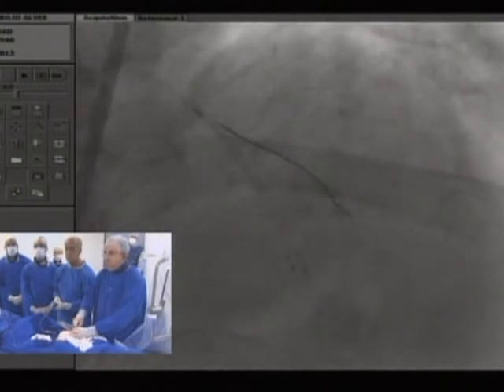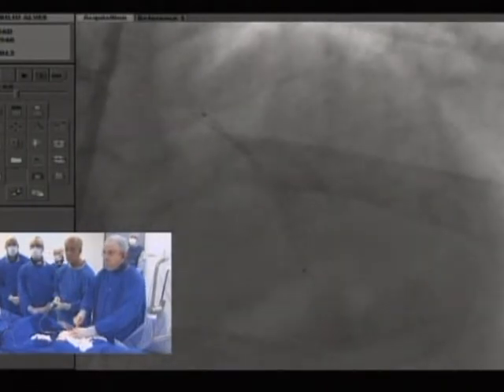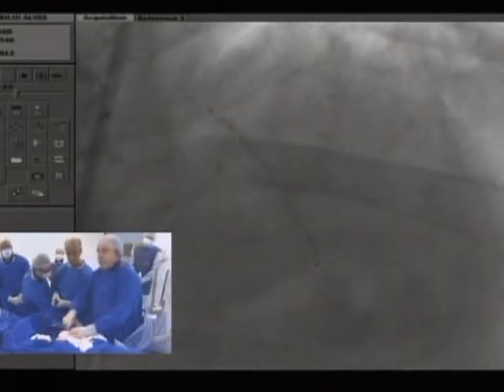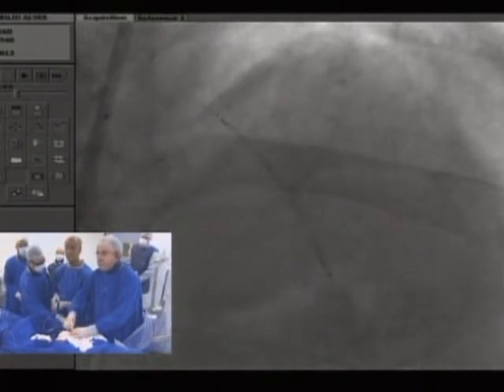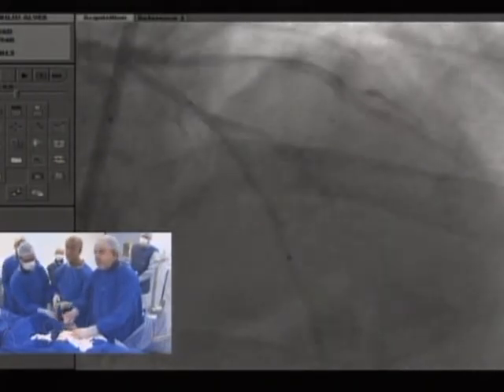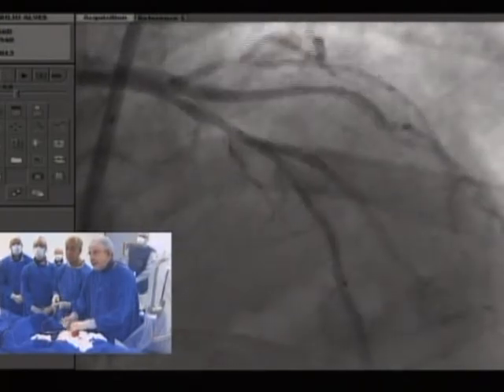And also, the angulation here is not so easy to evaluate. Why did you take the wire out? Yeah, that's an interesting question. You're nervous to leave the wire? I generally leave the wire there. Yeah, I do too. I as well. Although it's interesting that there are a number of people who don't.